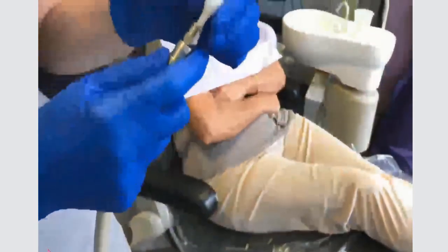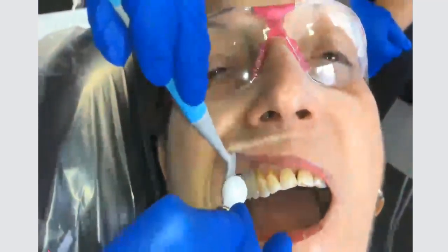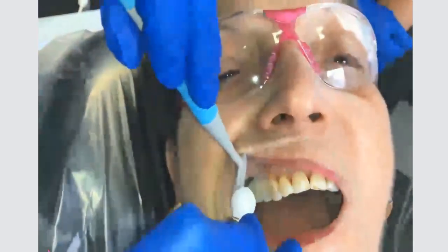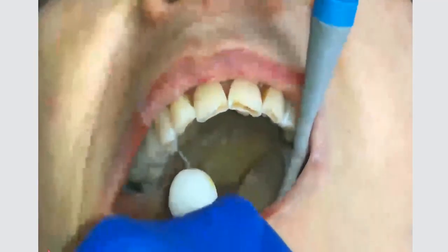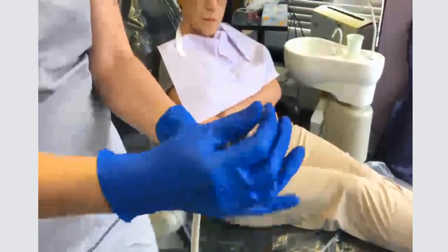So the hand piece is in place, nice and tight. You're going to hold the metal nozzle between 1 and 4 millimeters from the tooth surface at an angle of 30 to 90 degrees. Spray each side of the tooth for a maximum of 5 seconds per tooth. Don't concentrate the spray in any one place. You're going to use it like a brush motion. I'm actually going to show the video again.